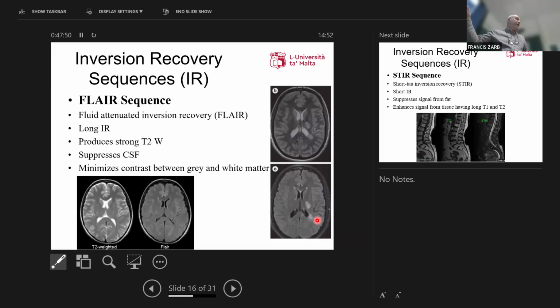Mela, fil-kas tal-brain, il-FLAIR tintuża for multiple sclerosis. Fil-fatt, it's one of the standard sequences tal-brain. So, meta tagħmel brain scan normali, you would add the FLAIR wara jew skont il-request. Ara, a general standard brain scan. Tajjeb, għax inti apparti multiple sclerosis, anke jekk għandek other pathologies in the brain, ħafna drabi sa jkollok edema related to it, mela it's very sensitive to detecting edema, abnormal fluid.